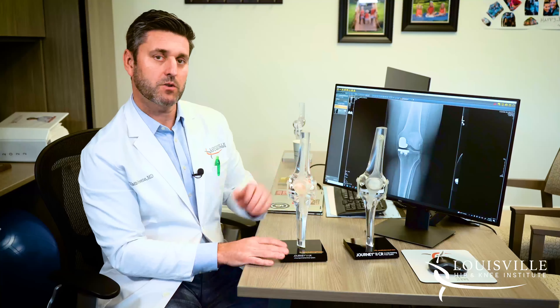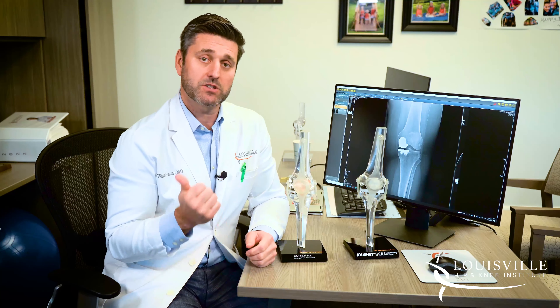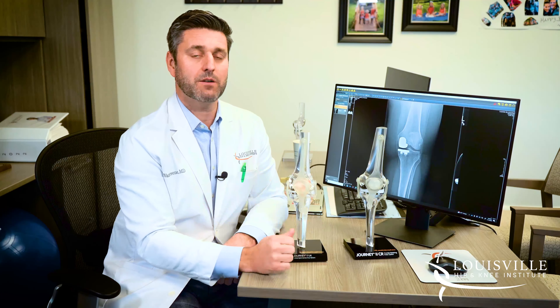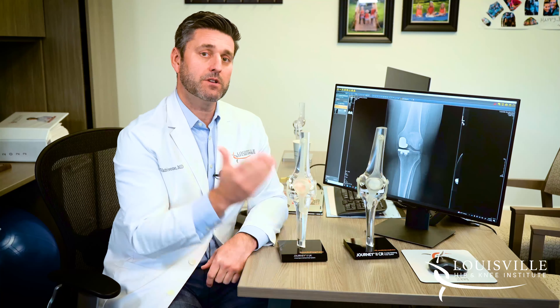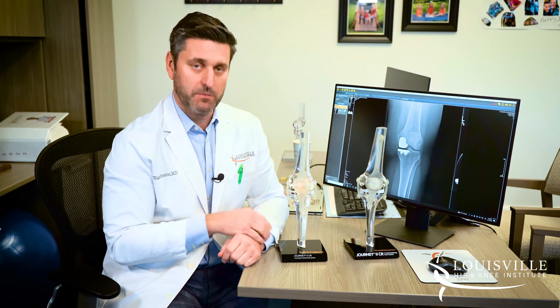This is a partial knee replacement. When we talk about the knee, we talk about three areas: we talk about the inside, which is the medial compartment; we talk about the outside, which is the lateral compartment; and then we talk about where the kneecap meets the thigh bone, which we call the patellofemoral compartment.